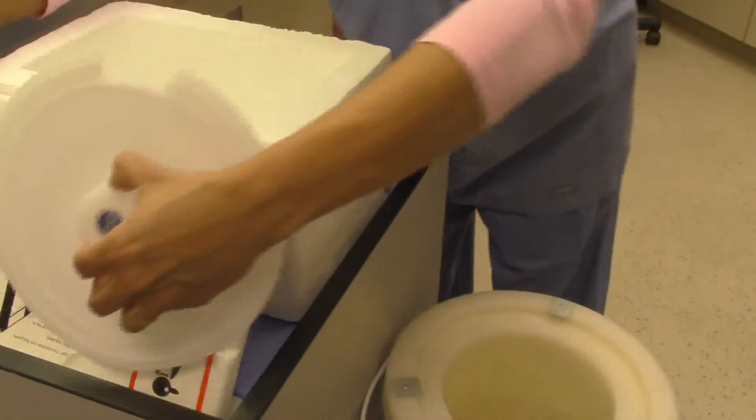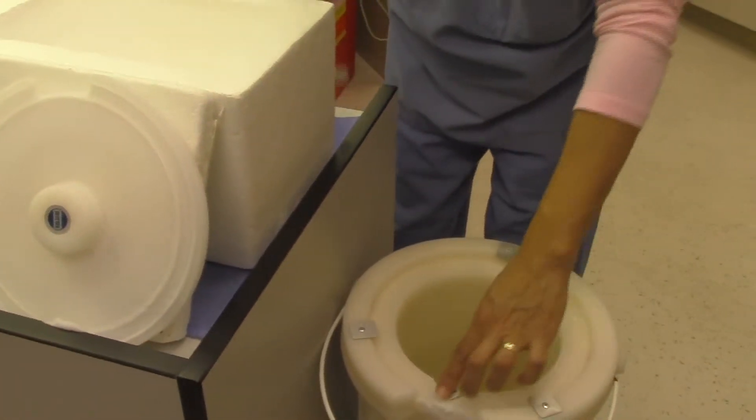In 16 minutes you can freeze two eggs per straw. The straws are then maintained in their own canes, each patient on their own cane.